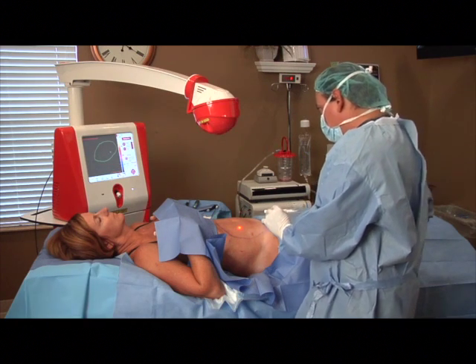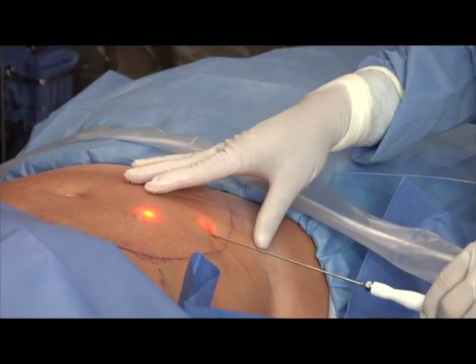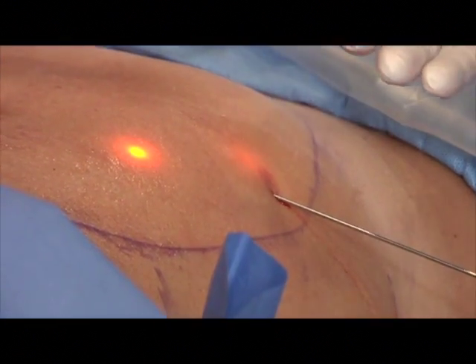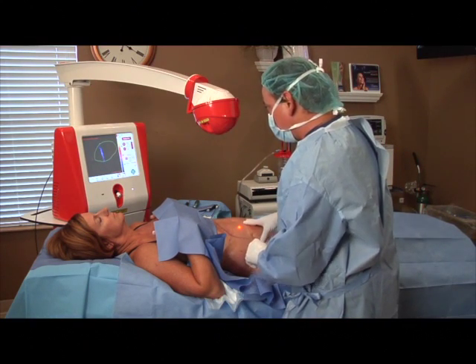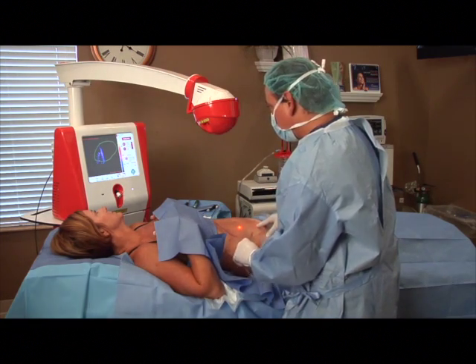So now we have a circle drawn of the half of her abdomen, and we put the laser probe underneath the skin into the fatty layer, and then I'm going to activate the laser so you'll hear a beeping sound. Now we've got the laser in, and it starts out with kind of a blue color, and we're going across the area just kind of like you're coloring.